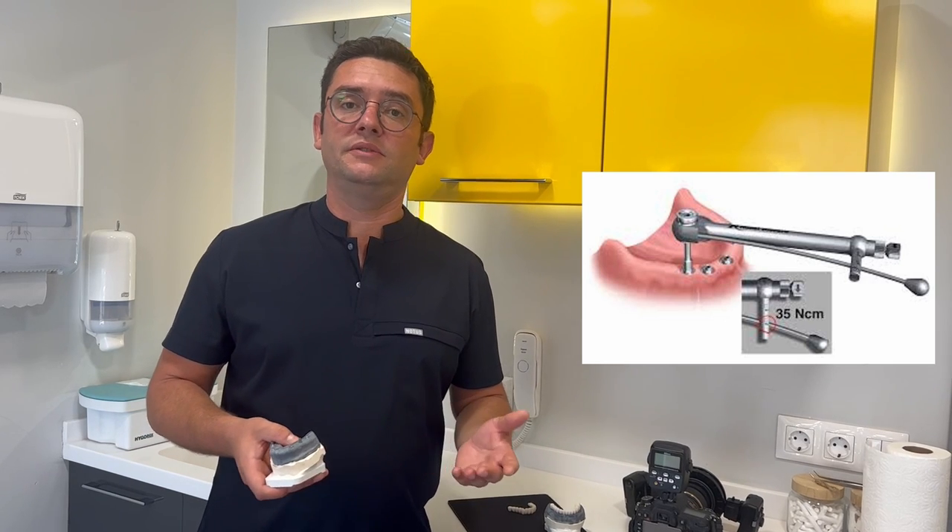If the torque value is more than 30 Nm, then we can load these implants with temporary dentures. However, if this value is low — depending on bone density, bone grafting, etc. — it means the implants are not ready to load and they have to wait a minimum of 3 months under the gum. In these cases, we make a removable denture for the patient to use until the implants are ready.